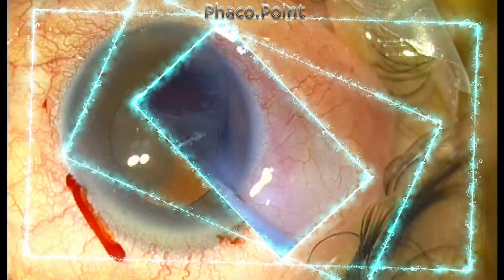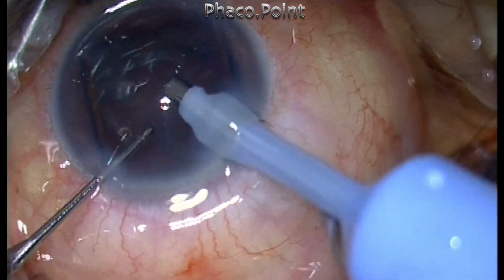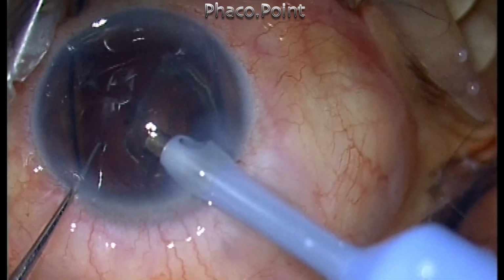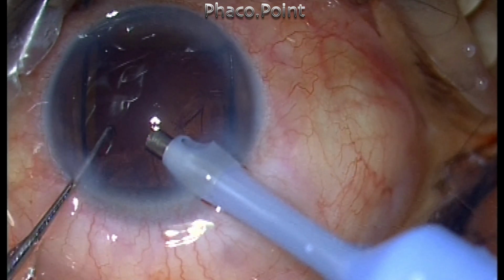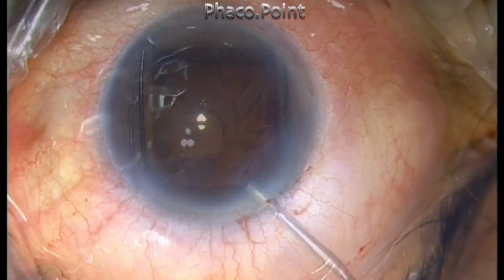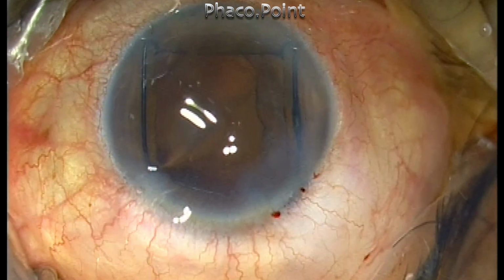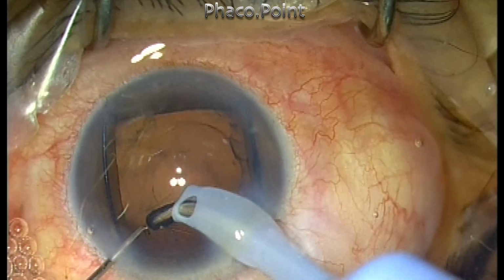Let's come to the end of the phaco, after the nucleus has been successfully emulsified, and now I'm working on the epinucleus with the phaco probe in the epinucleus mode. I'm able to get out all the epinucleus. While doing the cortical aspiration, I noticed something very peculiar because this bag was housing a very large nucleus.